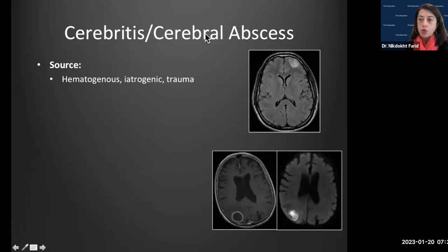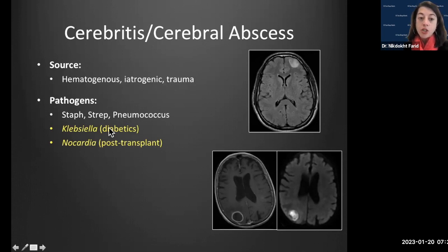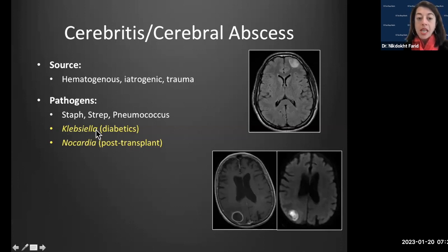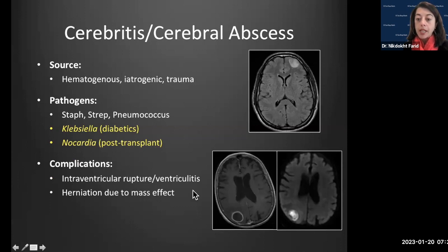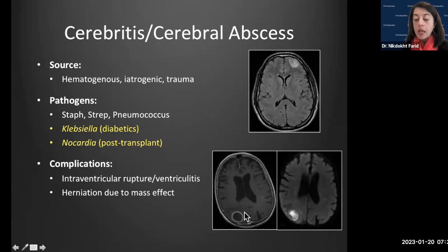Cerebritis and cerebral abscess exist on a spectrum, usually from hematogenous spread, but also iatrogenically from instrumentation or penetrating trauma. Notable pathogens: Klebsiella is more common in diabetics, and Nocardia in post-transplant patients. Our role is to look for complications: if an abscess ruptures into the ventricles, the patient is at risk for ventriculitis.